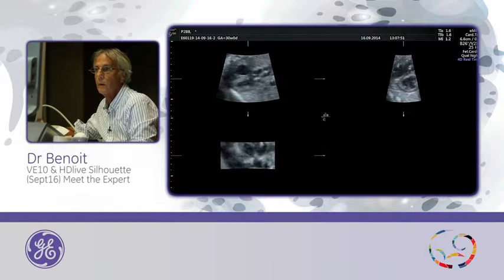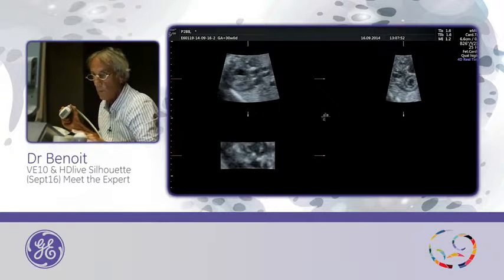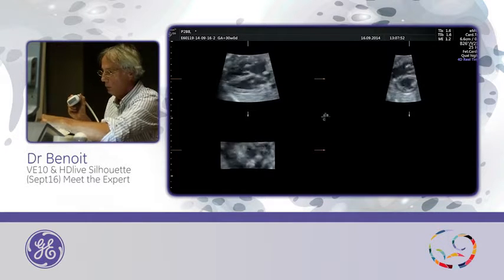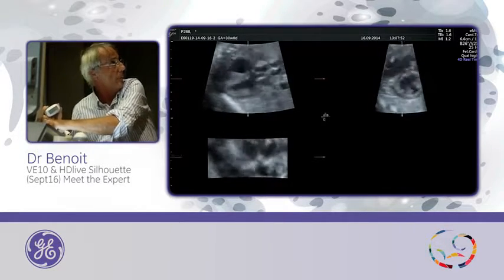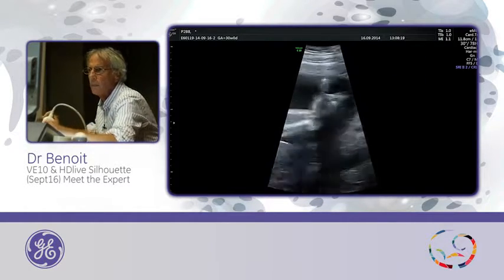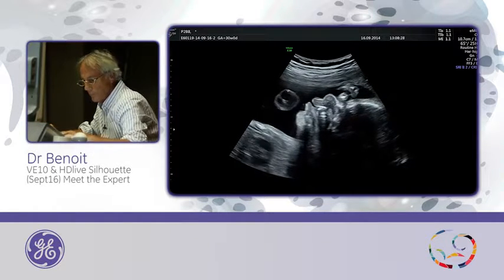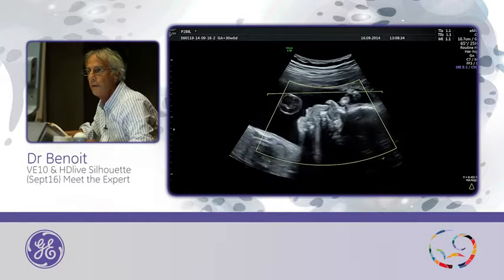Freeze. It's okay. And now within the heart, I will move. Start. And this is not a STIC, this is a 4D. That means it's really fast, and the quality, you can really work with this. Now I really like to use 4D.